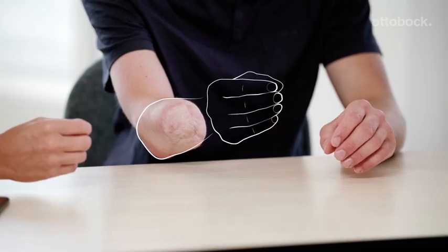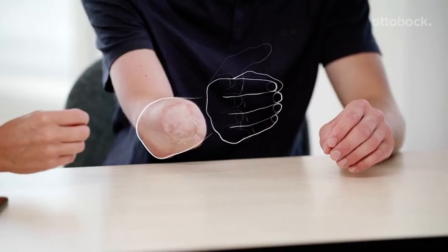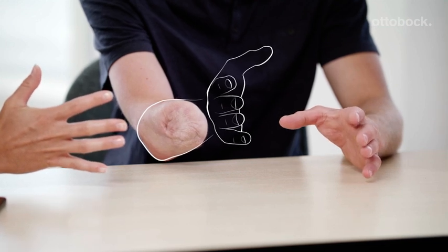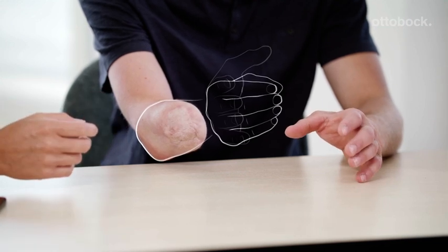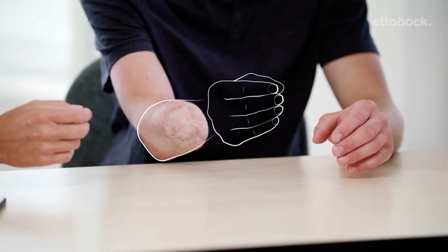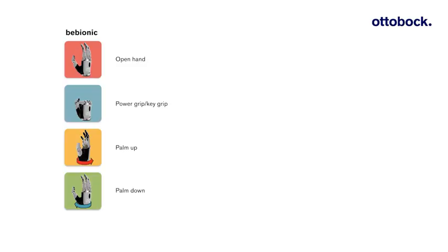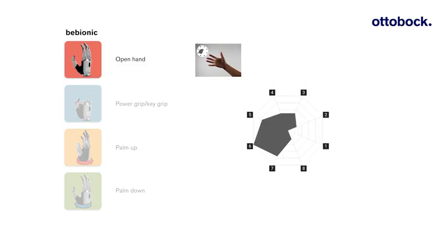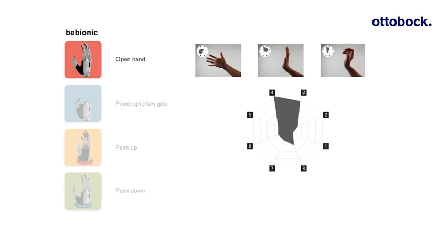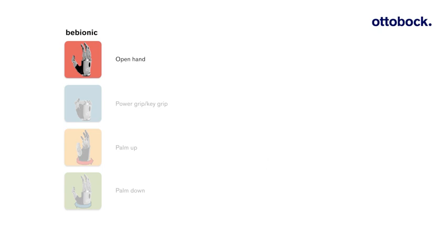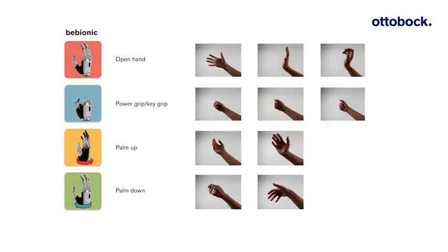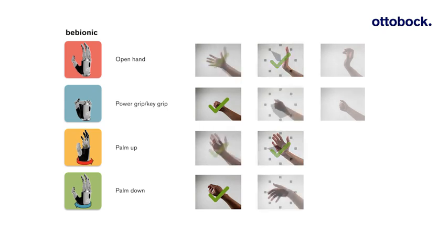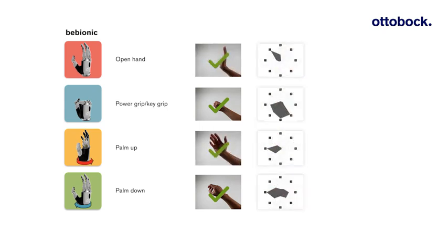To get a better idea of the phantom hand movements, advise the user to mirror the movements with a contralateral hand. Each phantom hand movement creates a particular movement pattern. The goal is to find a pattern for each phantom movement that is well separated from the other movement patterns. Once four suitable movement patterns have been found, they can be recorded in the test set.